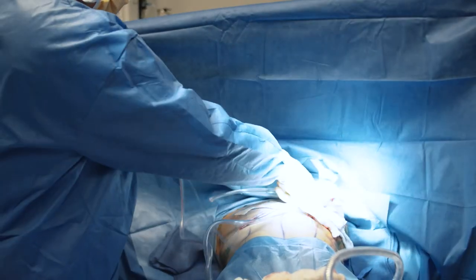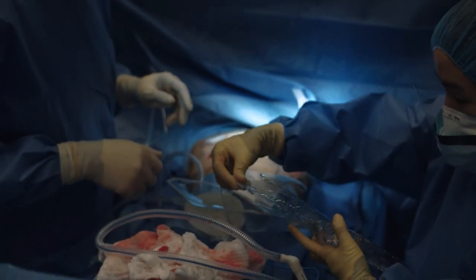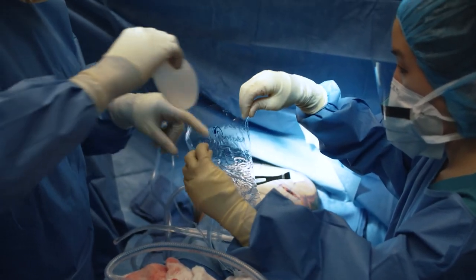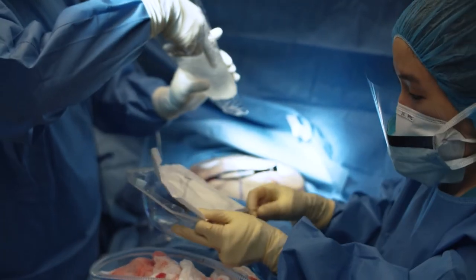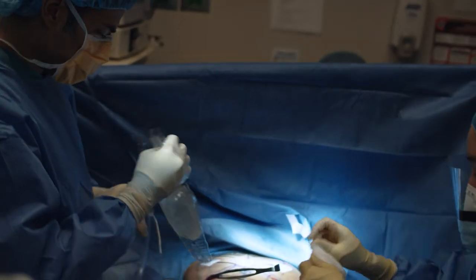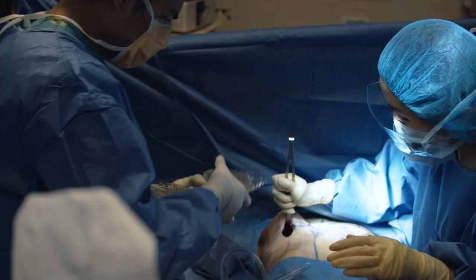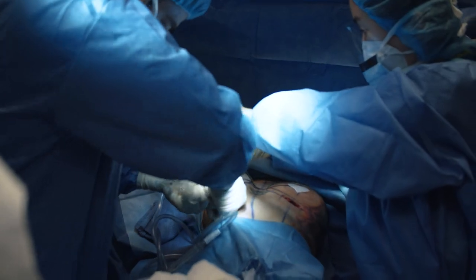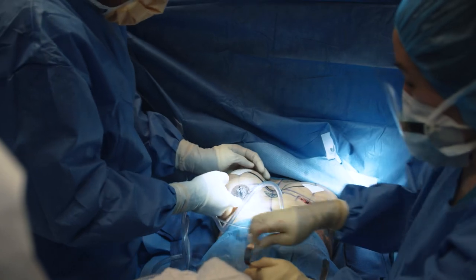Okay, now we're going to load the implant in our funnel. We're using a minimal touch technique. Now we have to position the implant so that the marker is lined up perfectly. So Janelle is in position to retract. Then I'm going to put the implant in there with the guidance of the funnel. See, that marker is perfectly lined up. That's what you have to do with these cases.